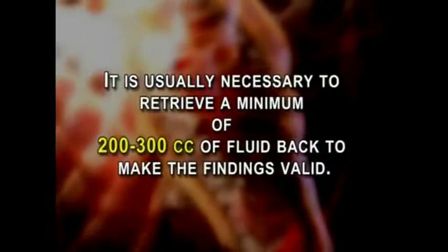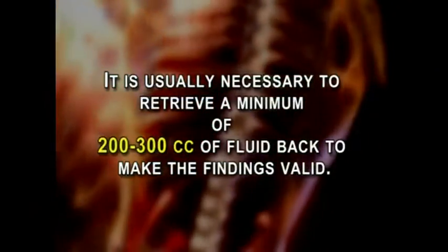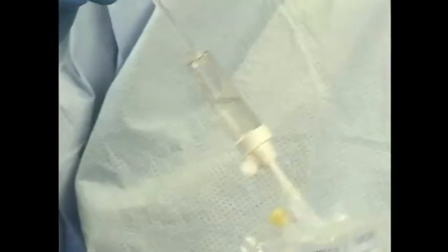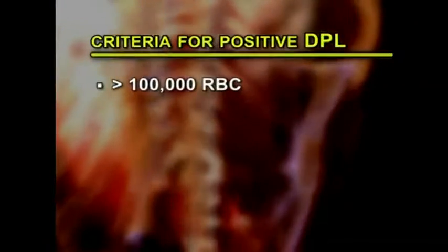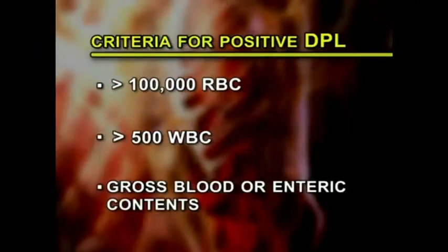It is usually necessary to retrieve a minimum of 200 to 300 cc's of fluid back to make the findings valid. A sample of this aspirate is then sent for analysis. The criteria of a positive DPL for blunt trauma are greater than 100,000 red blood cells, greater than 500 white blood cells, gross blood or enteric contents.